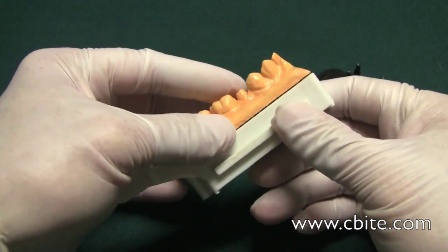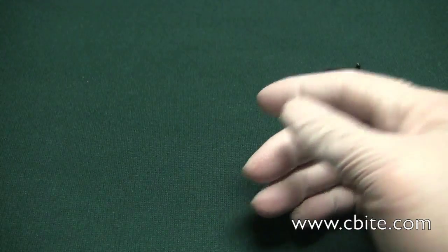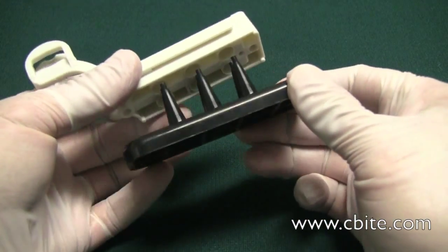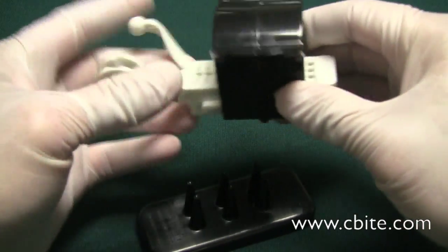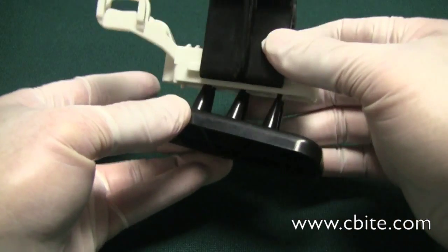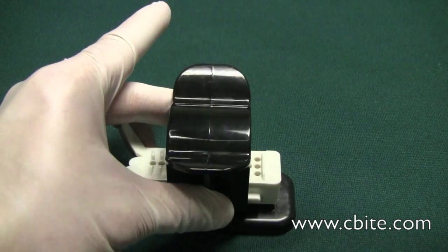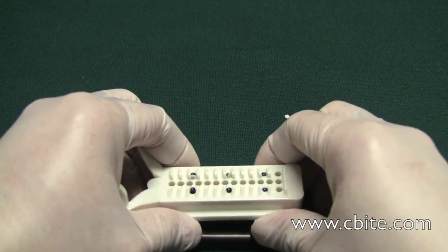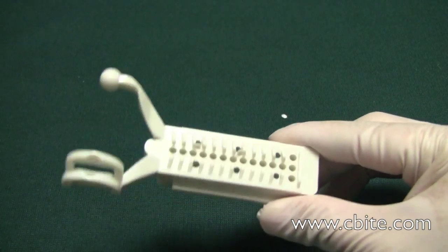This one has already been ejected, but let me show how that works on the articulator without the model on it so you can understand the process. You put this under there, under the guides, and tap it. As you can see, what it does is break the thin membrane on top.